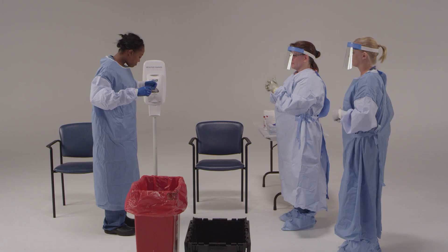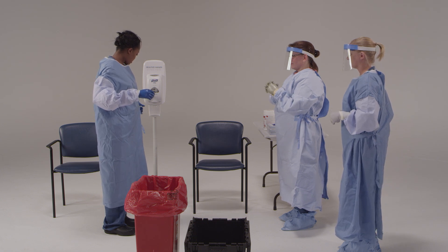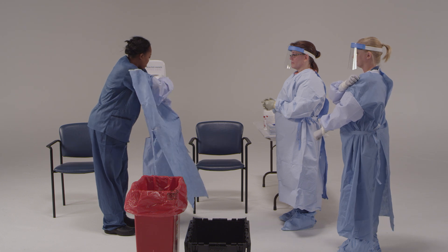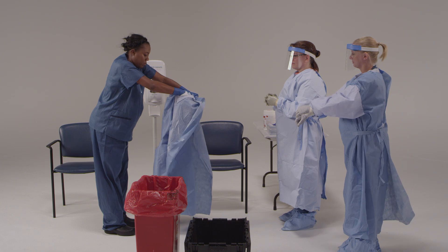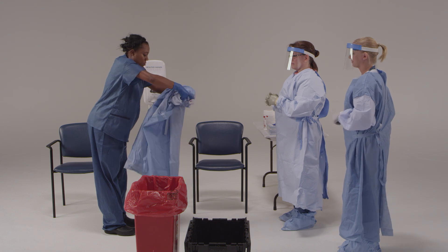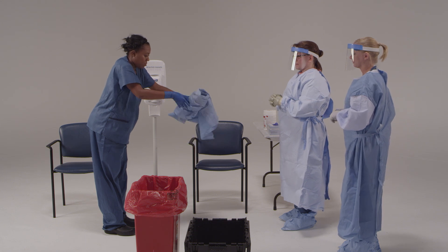Now go ahead and remove your gown. First, release the tie. Then pull the gown away from your body, being careful not to touch the inside with your hands. Be sure to move slowly and deliberately to avoid contamination of any exposed surfaces. Once the gown is off your shoulders, pull the gown down one arm and then the other. Roll the gown inward as you progress downward until it's a tight ball. Dispose of it into the trash receptacle.